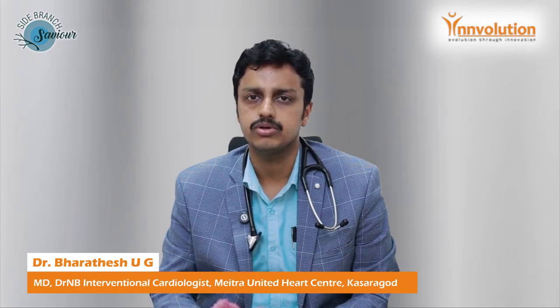Basically, we look for the TIMI flow. If the TIMI flow is not good, if it is TIMI 1 flow, we say it is a bad result. If the TIMI flow is good, that means TIMI flow is 3, then we say there is a good expansion of the stent and the stent is well opposed and expanded. So it is always better to have a good TIMI flow, which helps in preventing restenosis.